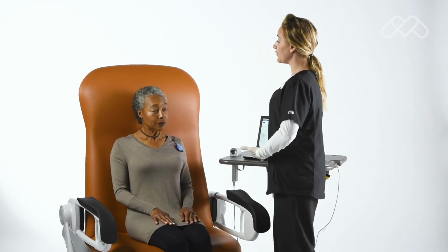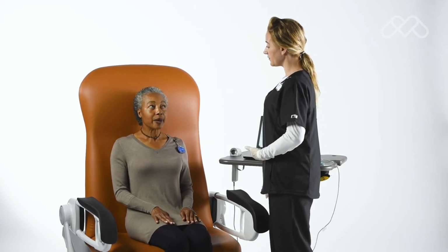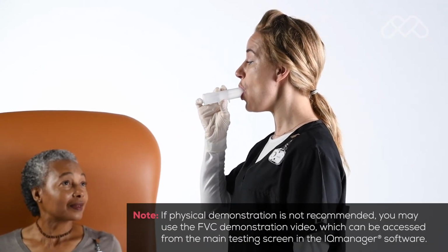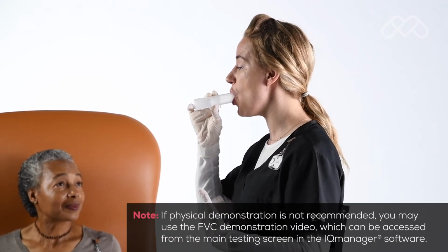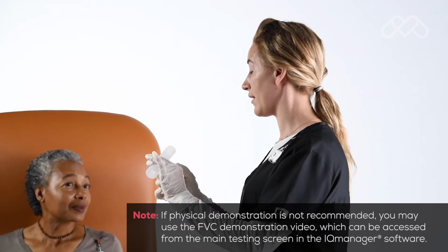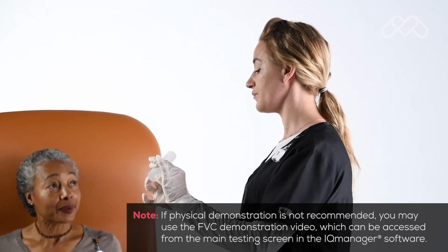And when instructed, they will take a deep breath in and then place the mouthpiece on top of their tongue with their teeth and lips around it to create a seal. The patient will then blast out as hard and as fast as they can for as long as they can. Instruct the patient to not block the opening of the mouthpiece with the tongue or teeth.